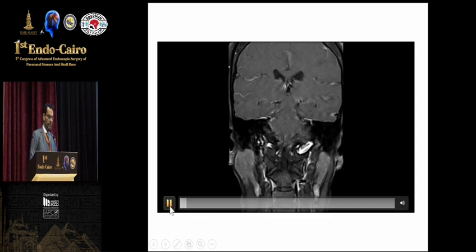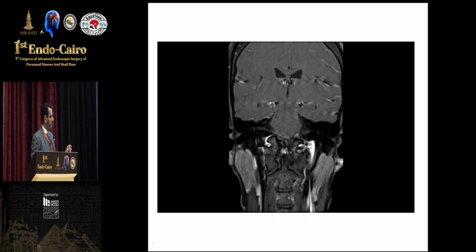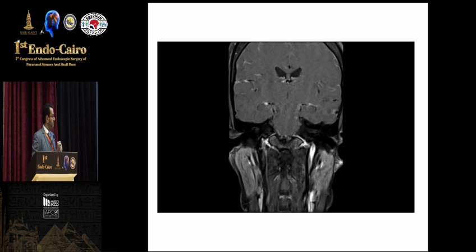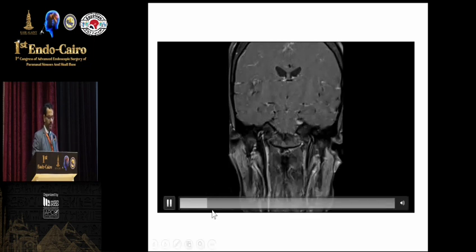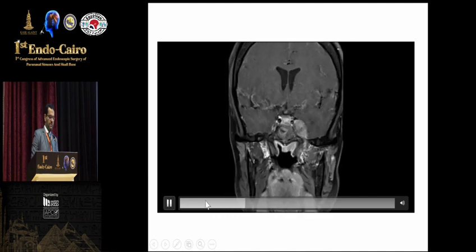So now the MRI is playing, T1 with contrast, and I'm going from posterior to anterior. Let me show you what we have.